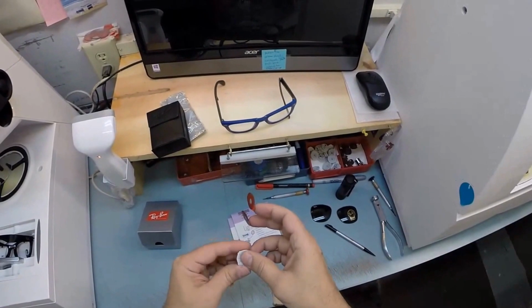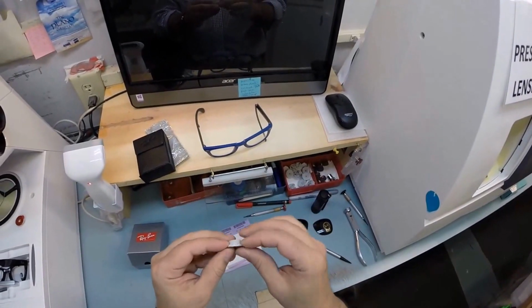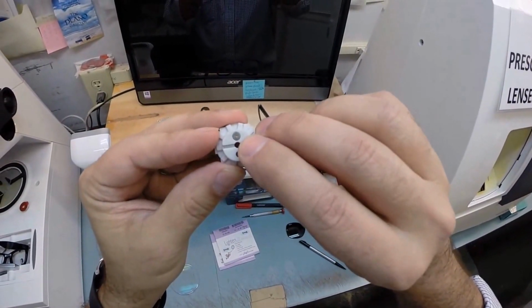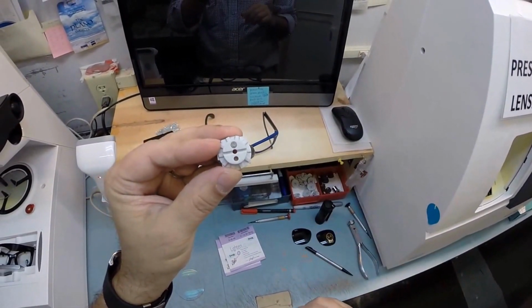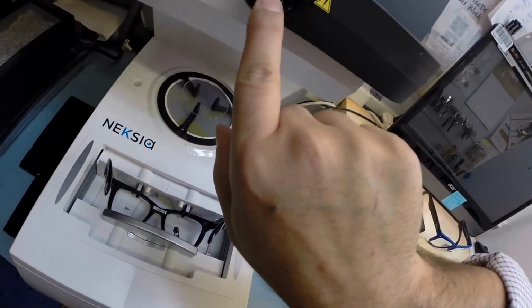So I'm going to stick that onto the first block. Stick that one onto the second block. Now if you notice on the back there's a little silver button. That is a magnet. That's going to do its job twice today. The first time it's going to hold it in place to something magnetical there in the arm.